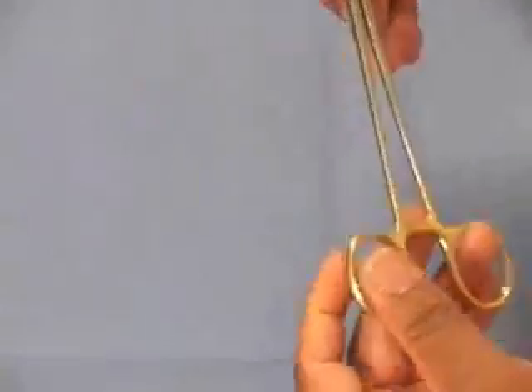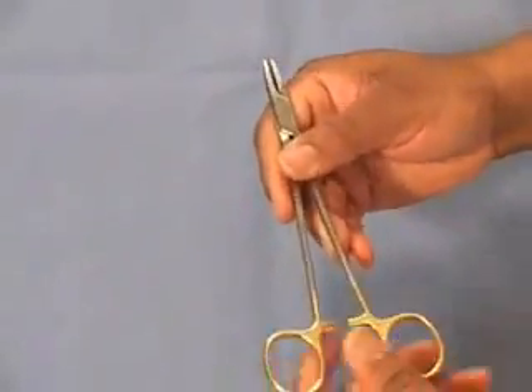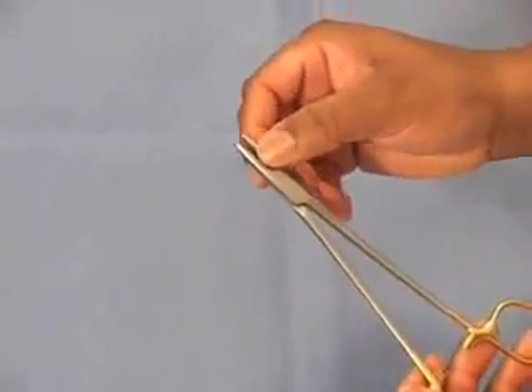Let's start by examining the needle holder. This is a ringed instrument. You'll notice that there are two rings in back, a ratchet, the shaft or body of the needle holder, the hinge, and then the jaws of the needle holder.